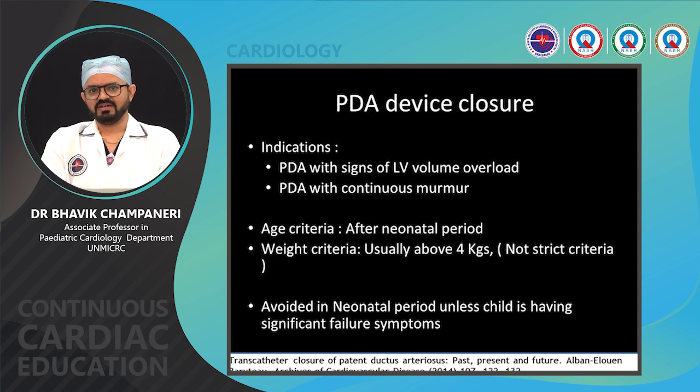Weight criteria: it's usually done above 4 kilogram of weight, but it's not a strict criterion, as we have discussed that preterm PDA devices have also come, where people are doing PDA device closure in babies as low as 800 gram and 900 gram of weight.